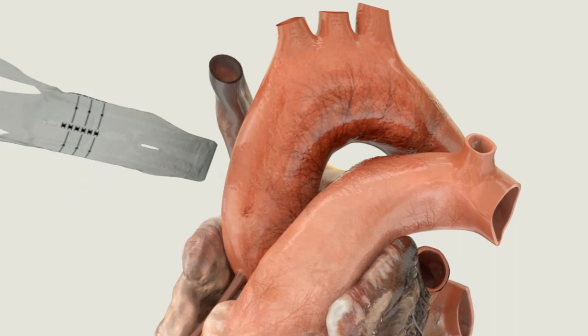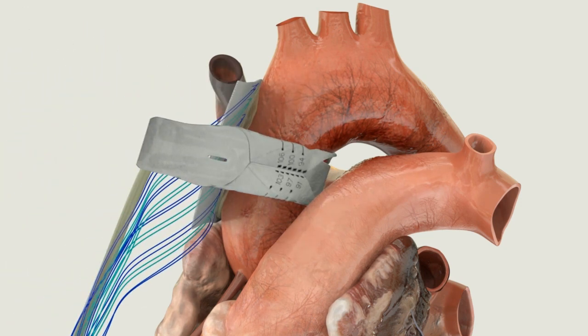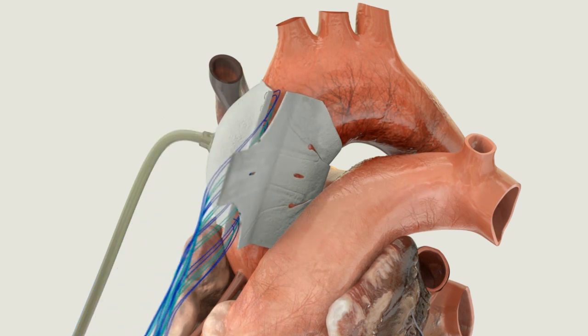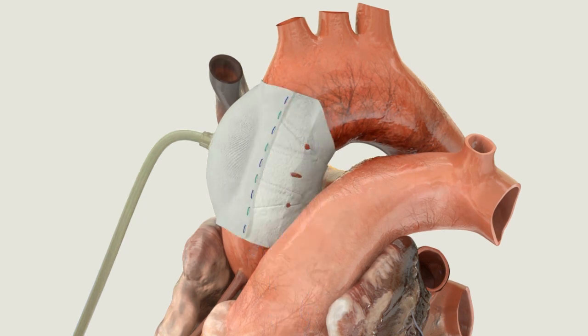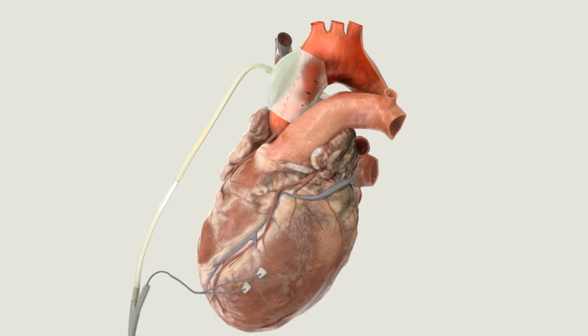The C-Pulse Heart Assist System consists of a Biospan polyurethane balloon and Dacron cuff fitted to conform to the ascending aorta. The balloon inflates inwardly, causing a thumbprint deflection of the outer curvature of the ascending aorta. The low strain rolling action of the balloon is designed to minimize stress on the ascending aorta.